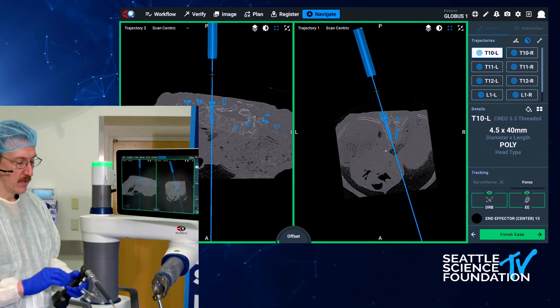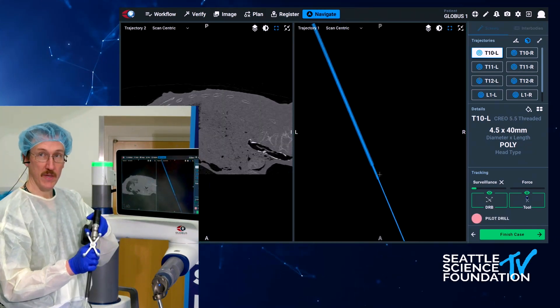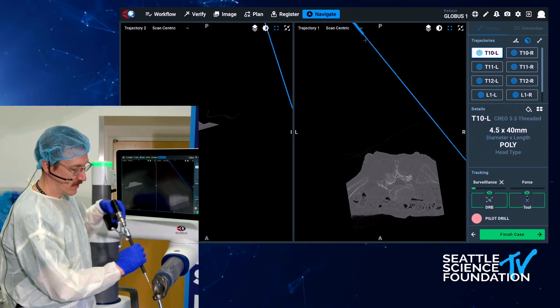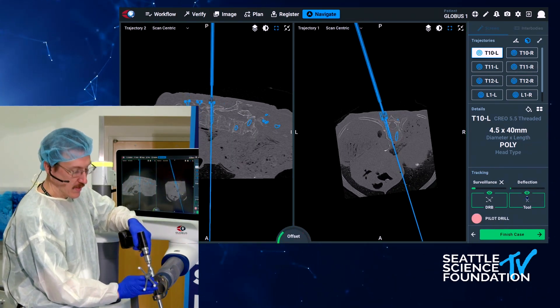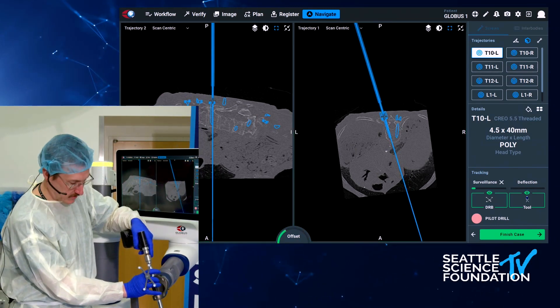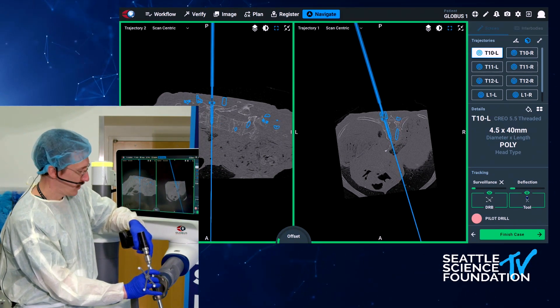Now we have green. I have to bear in mind that the reference frame has to be able to see the camera in order to be registered, as well as the end effector arm itself. And so now we are in position, and we can start the drill off of the patient and drill our screw.